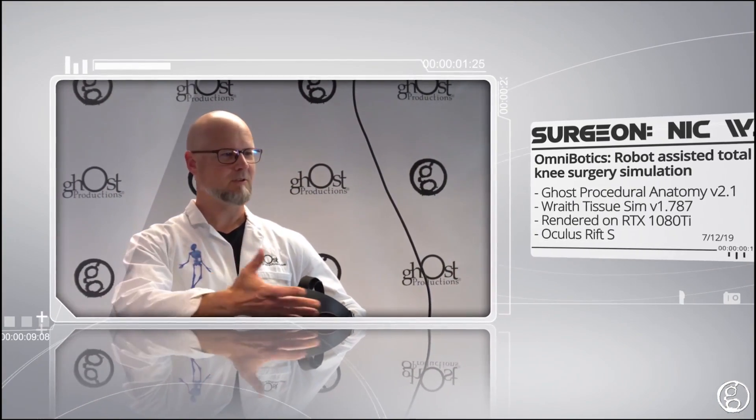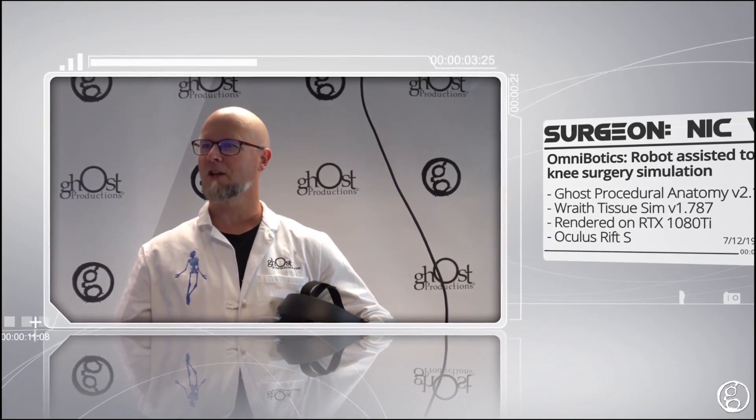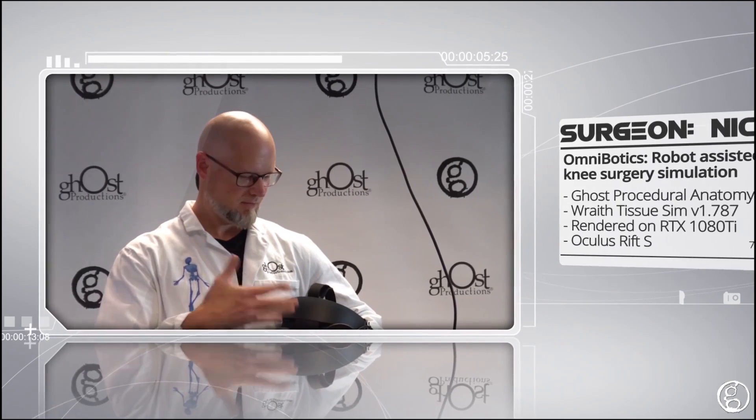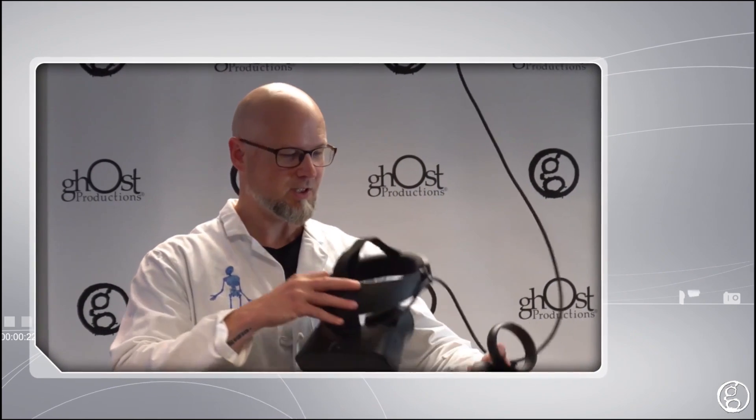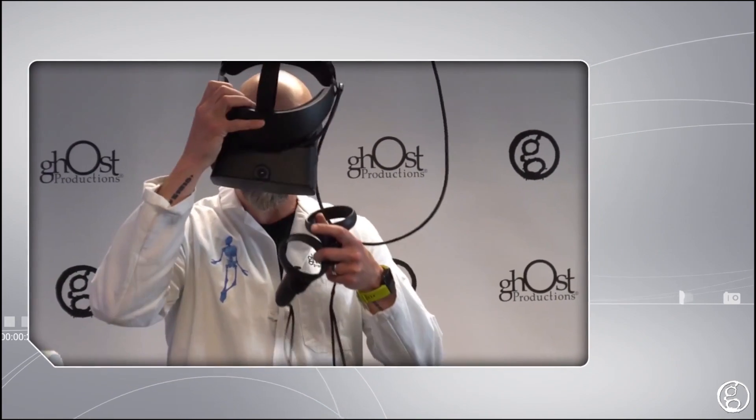I'm Nick. Welcome to our Ghost Productions VR Lab. I'm going to show you something that we've built — a great demo on this new Oculus Rift S system. This is our new system here to show you our demo. So without any further ado, I'm going to go into our virtual space.